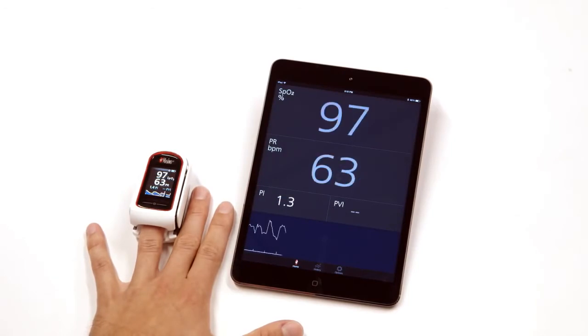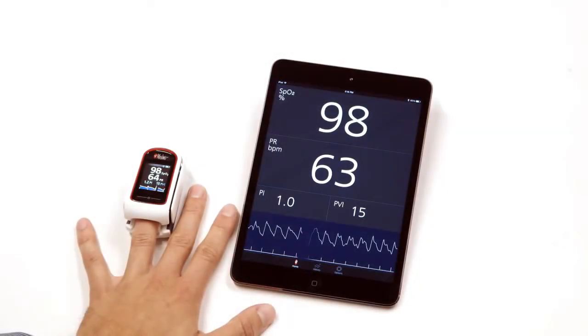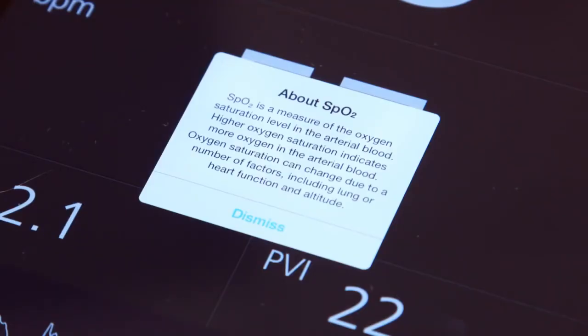Your app will now display all parameters including SpO2, PR, PI, and PVI, along with a plethysmographic waveform and Signal IQ. Tap on any one of these parameters on the app to see a detailed explanation of that parameter.